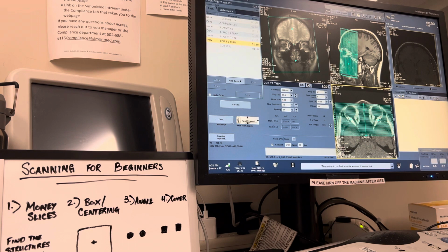Okay. Let's keep angling. Actually, let's scroll through and try to find a better image. So I want you to go down. Okay, now let's go back up. Keep going. Okay, right there. I want you to use that image. I want you to cut 1 more off the top and try to angle that.